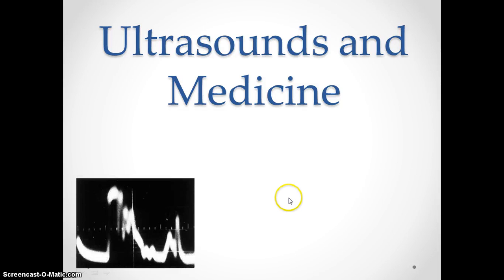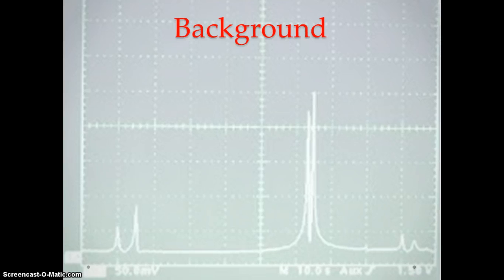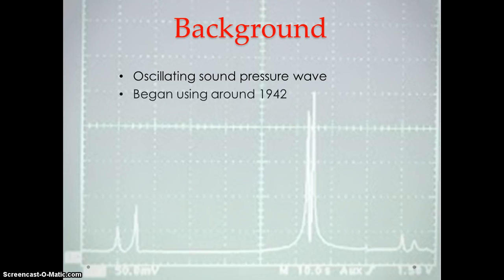Ultrasounds and medicine. Background. Ultrasounds are oscillating sound pressure waves with a frequency above human hearing, at about 20 kHz or above.